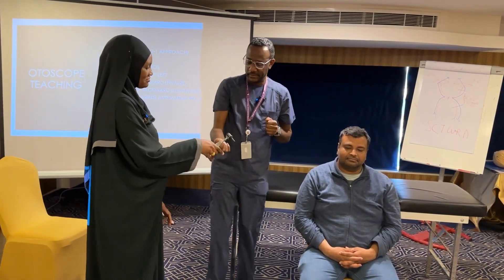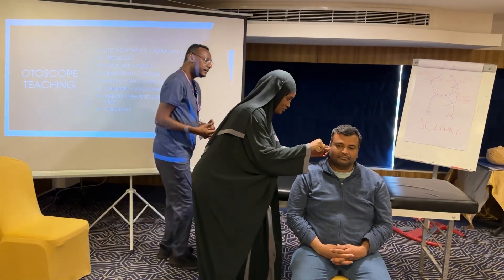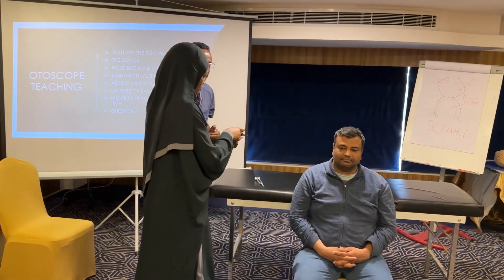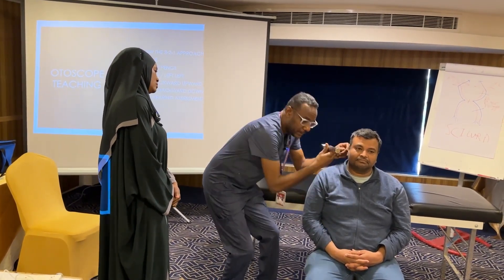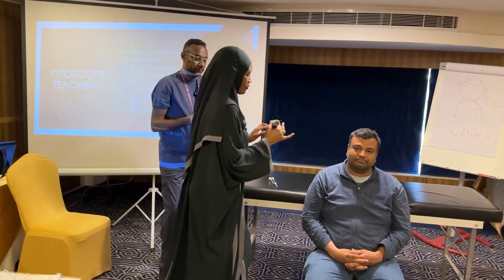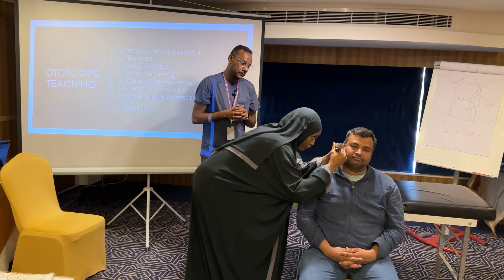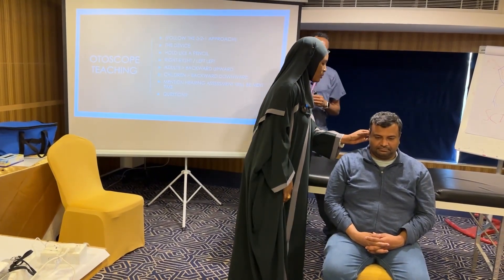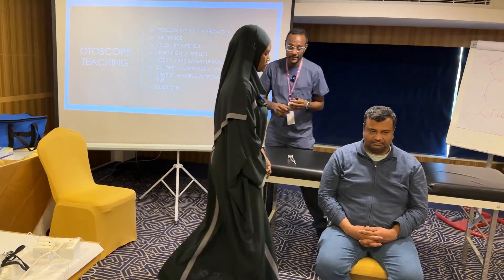Can you show me how to do that? Let me show you again. It should be held like a pencil, and then the edge of the little finger should be here on the cheek, like this. That's fantastic. And can you show me how to straighten the auditory canal in adults? In adults, we go backward and upward. Fantastic. Thank you very much.